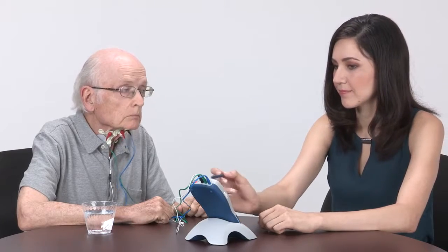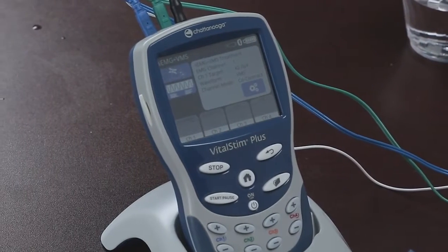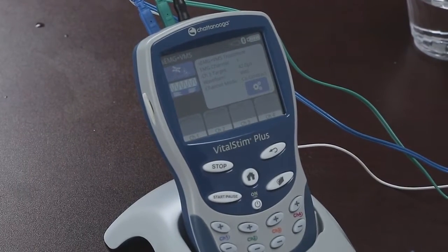Pressing EMG triggered stim from the home screen will get us in EMG triggered stim mode. In this mode, the patient is encouraged to work like before, but then when he reaches the threshold, the stimulation will kick in as a reinforcement of the effort.